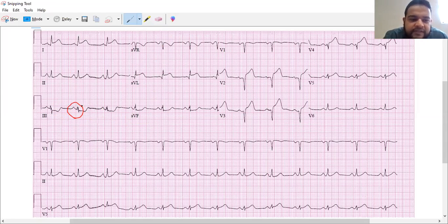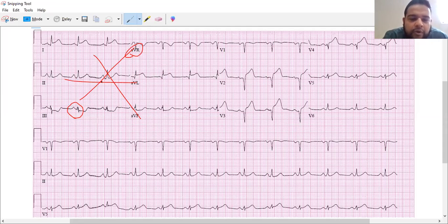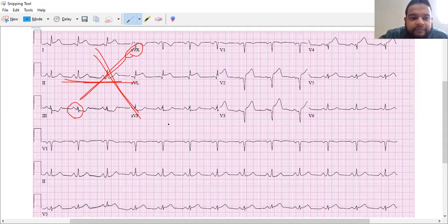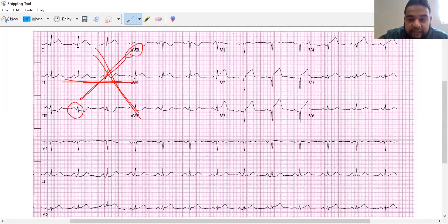The next step is to find the lead perpendicular to three. So which is the lead perpendicular to three? That's going to be AVR. So now we're going to look at what is... like the star method, where we just draw a star — that's our mnemonic. So lead three goes to AVR, AVF goes to lead one, and two goes to AVL. That gives us our perpendicular lead. So we narrowed down lead three and the perpendicular lead is AVR.